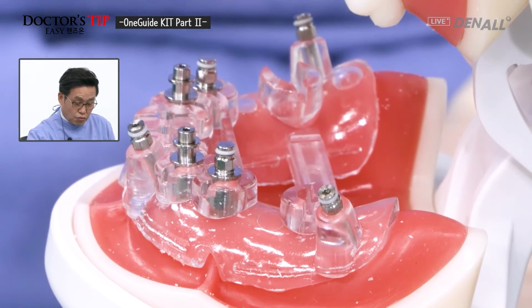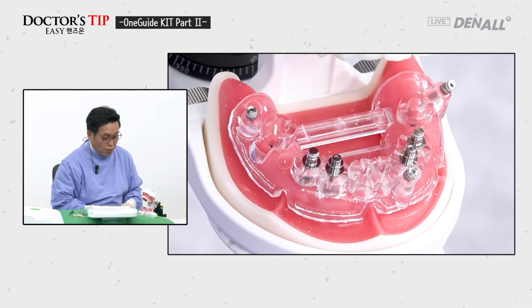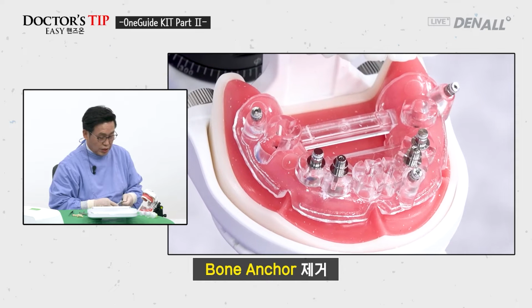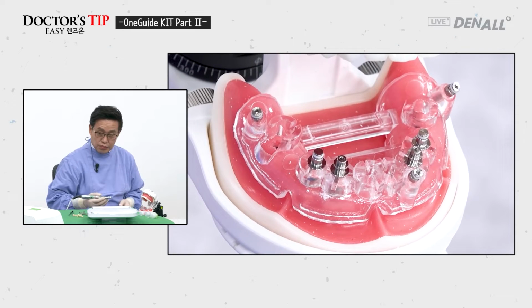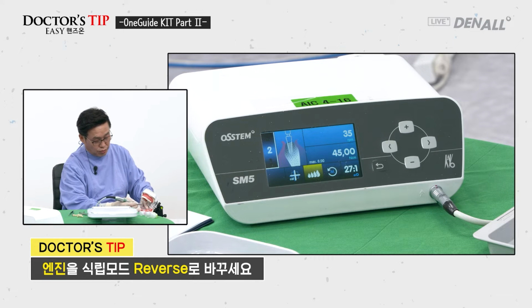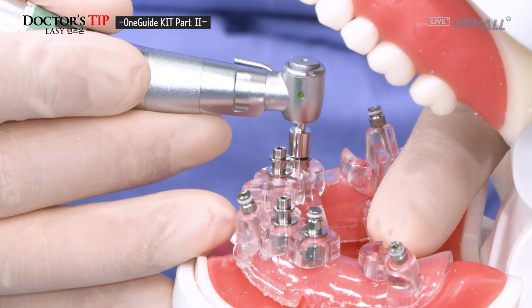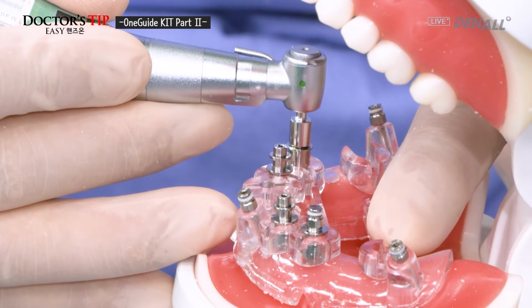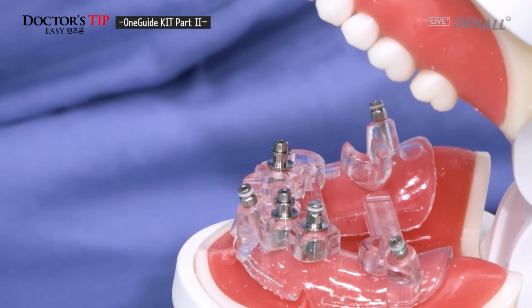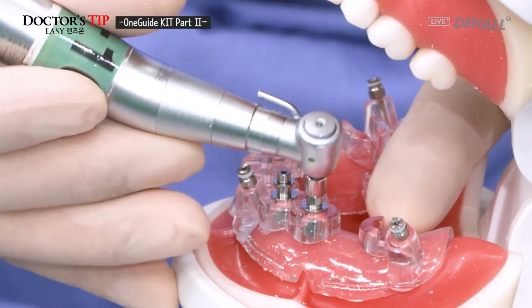So 6 on both sides is complete, and number 34 and 44, vertical anchors will be removed. I'm going to do reverse on the placement mode, and on number 44, vertical anchor is going to be removed. As shown, number 44 vertical anchor is removed, and number 34 vertical anchor is also removed.